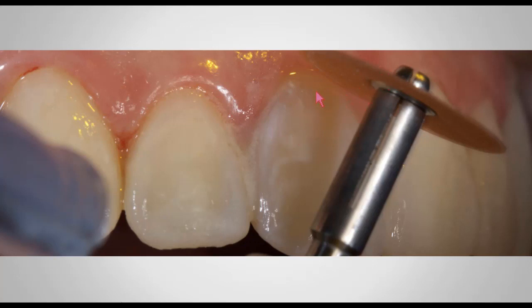And I just go around and smooth out all the margins, make sure that all the flash is out, and make sure that it's like a knife edge margin between that unprepped enamel and my margins of flowable composite. And I make sure that I do that all around every single tooth. At the end, I just grab an explorer, a very thin, sharp explorer, and I make sure that there are no retentive features in that gingival margin.